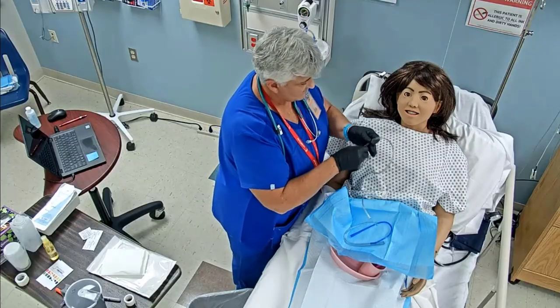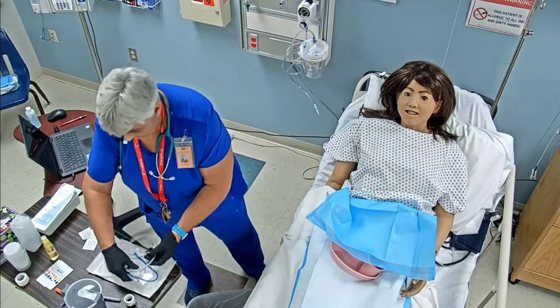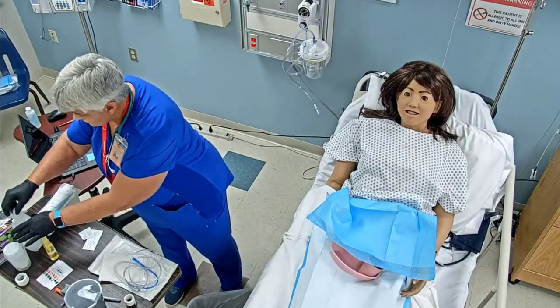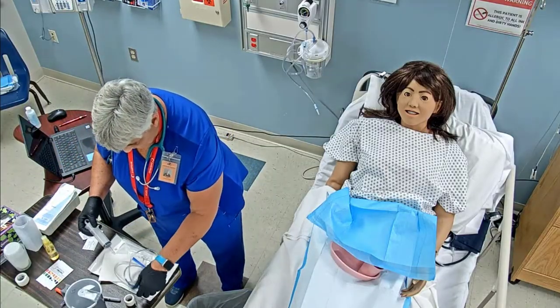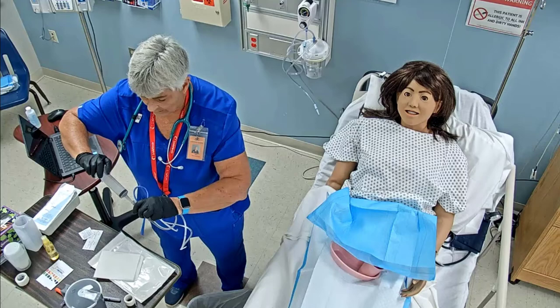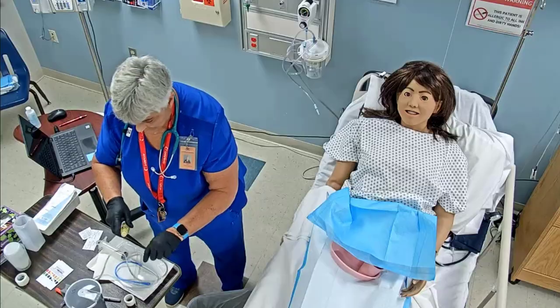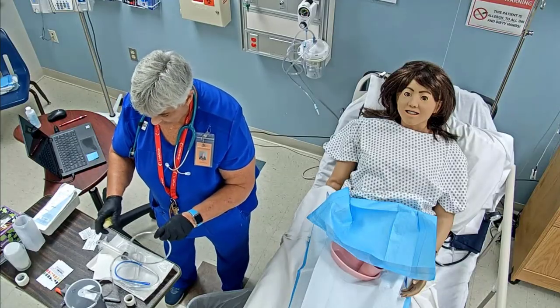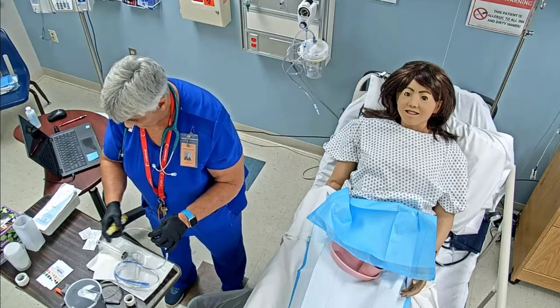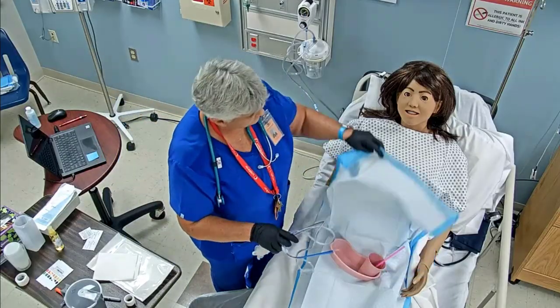Okay, so once we've done that, I might give it just a little bit of a twirl here. And next I need to go ahead and get my syringe on. Now this is an air vent, so you never want to put anything there, so I'm going to put my syringe on there. Okay, I'm going to make sure that I've lubricated my NG tube at least 2 to 4 inches. Okay, so it's lubricated generously. And I'm going to go ahead and put this over here.